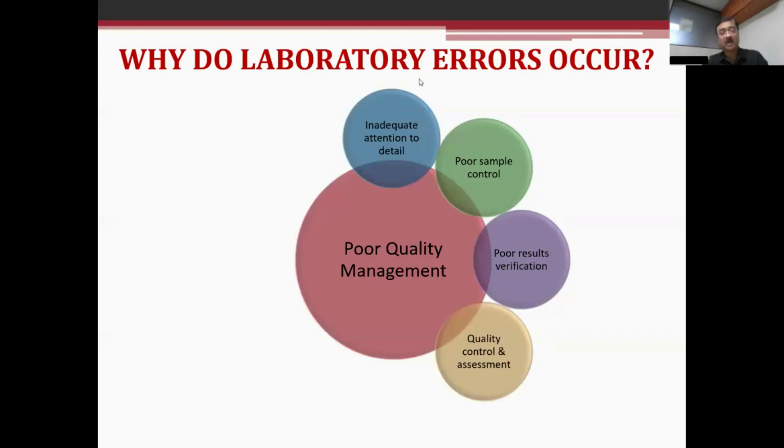That's a priority thing nowadays. Previously, in our college days, quality control was a concept we were not very acquainted with. Even when I joined my professional career, I had a very faint idea about proficiency testing or EQAS. And I think in our post-graduations, it was not discussed in detail either.